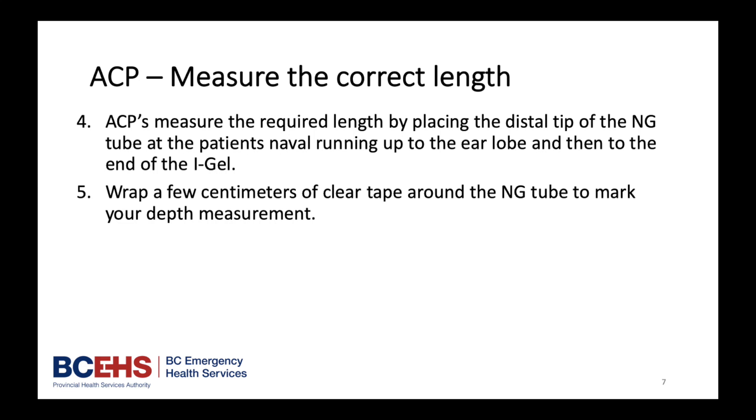Advanced Care Paramedics measure the required length by placing the distal tip of the NG tube at the patient's navel, traveling up to the ear lobe and then to the end of the iGel. Wrap a few cm of clear tape around the NG tube to mark your depth measurement.